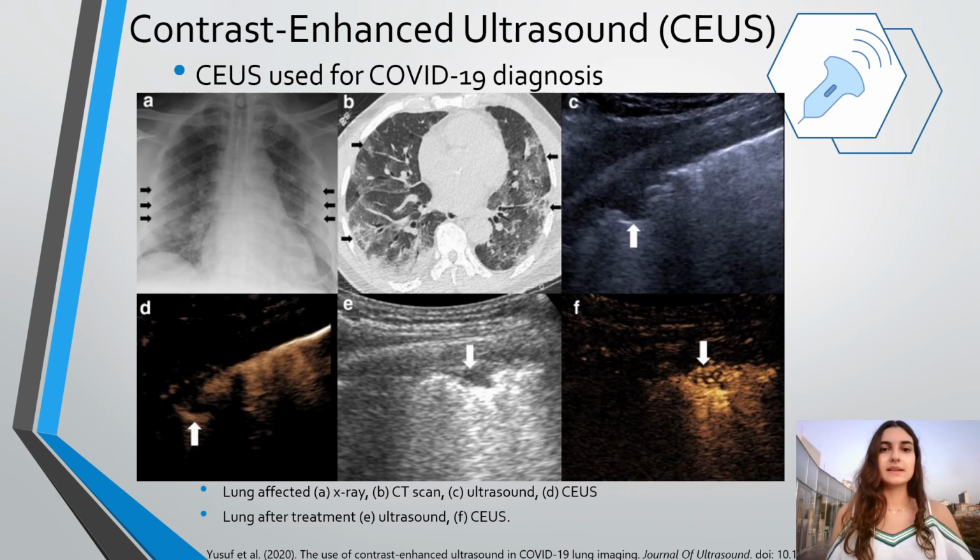Many studies examine the accuracy of lung ultrasound in detecting COVID-19 pneumonia. CEUS further characterizes the ultrasound features with the regions of infarction. CEUS is also inexpensive, radiation-free, safe, and may be conducted at the patient's bedside. Lung CEUS in COVID-19 aids in prognosis and treatment.